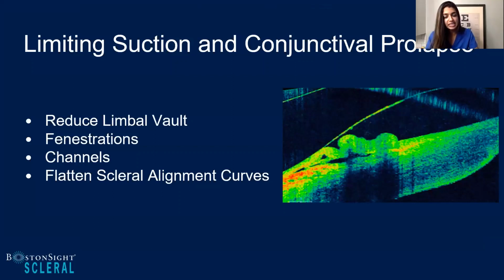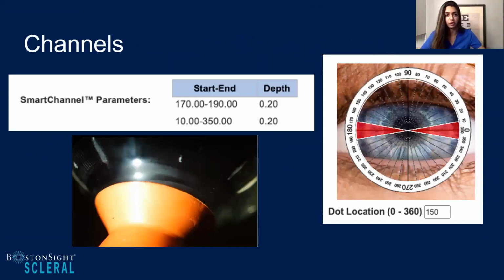And thanks to the team at Boston Sight, what we decided to do was introduce 2 channels for this patient on both of her lenses. So the channels I made about 20 degrees wide, and I kept them about nasal and temporal, and they were also about 200 microns in depth. The goal was I didn't want to make them too deep where then we'd have a source of fogging or an influx of debris. And with this, the patient came back with her new lenses happy.